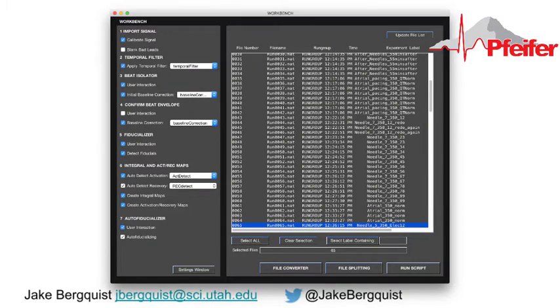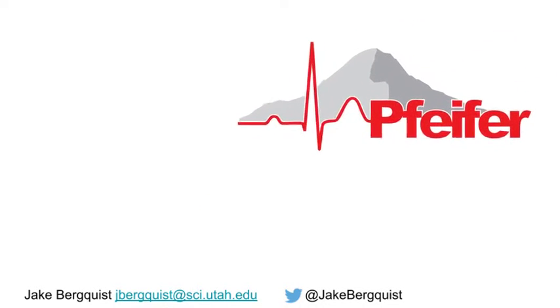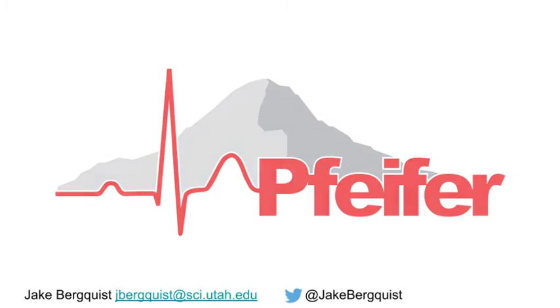What a mouthful. We also rely on a range of post-processing steps including filtering, baseline correction, and fiducialization of the signals. We accomplish all of this post-processing using Pfeifer, an open-source MATLAB package that we have developed and maintained.